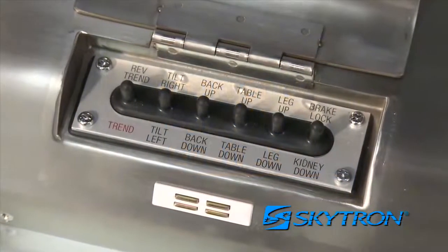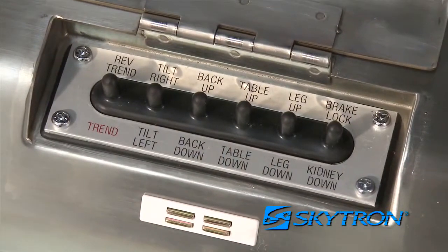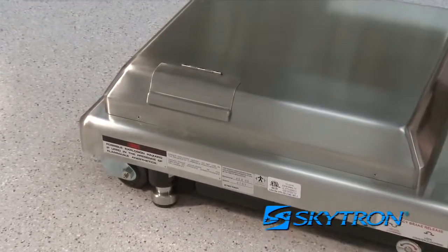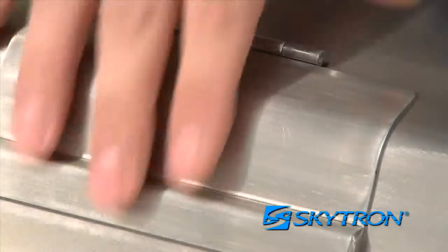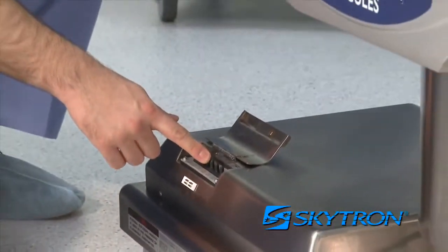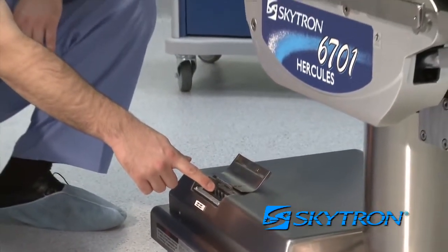The table is also equipped with emergency backup control functions in the event of a power outage or pendant control failure. Control switches are located under the access door cover in the table base. Simply push the desired emergency switch in the appropriate direction to operate table functions.